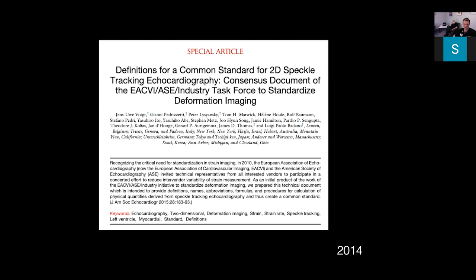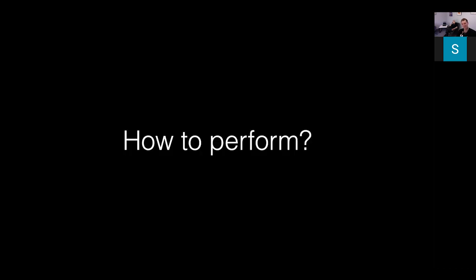And that's what this says here. So they recognized there was a need for standardization, right? And at the end of it, they called for us to ask the vendors to do their best to do things in a similar manner. And if you're doing one thing, just do it on the same study, as I said.